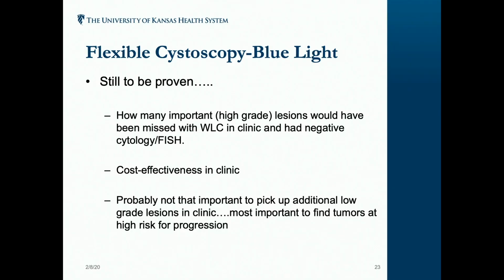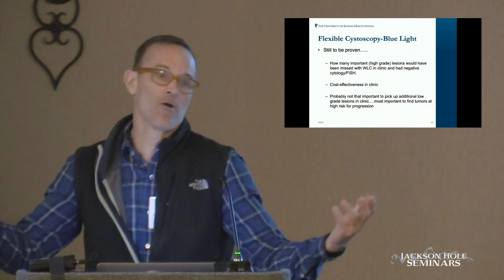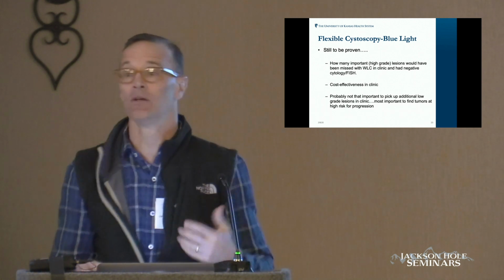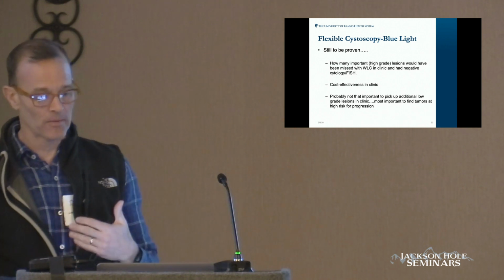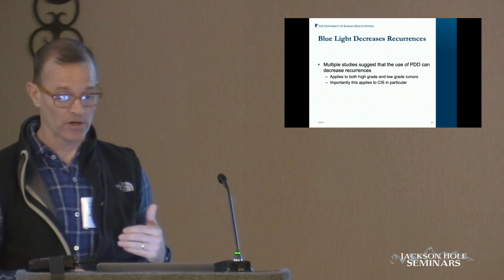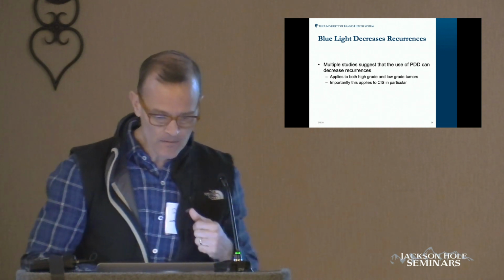The other thing that I think is probably the biggest factor, again, Trinity and I were talking about this, is the flow in clinic. They have to come in, they have to get the catheter, they have to get it instilled in their bladder, they have to wait an hour. How you manage that in your clinic practice when you're doing 8 or 9 cystos in a half day is really challenging, and I haven't figured that out. So I think those are some of the challenges, but the data do support its use if you're trying to increase detection in that instance.